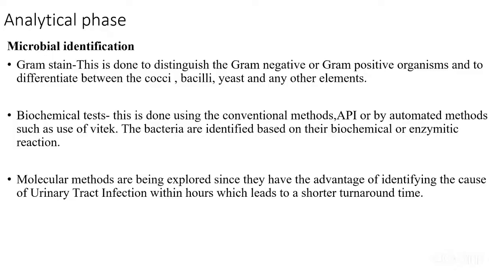After the incubation, you'll either read the API directly or you will need some reagents that will reveal the reactions, the biochemical reactions of the organisms. Then you will tabulate the numbers and compare them to a set standard so that you can know which organism you are dealing with.